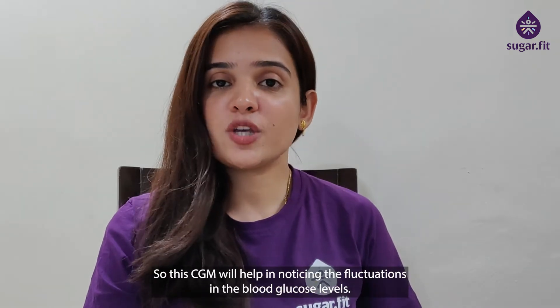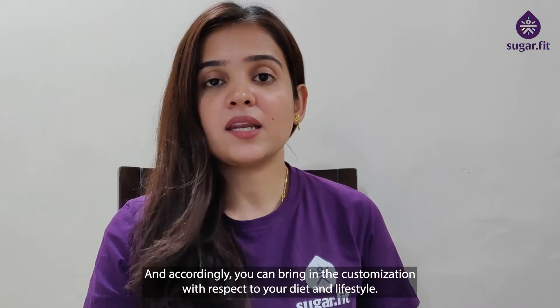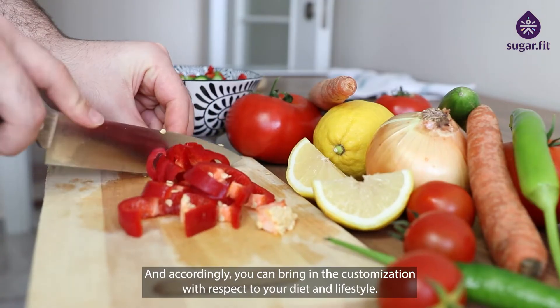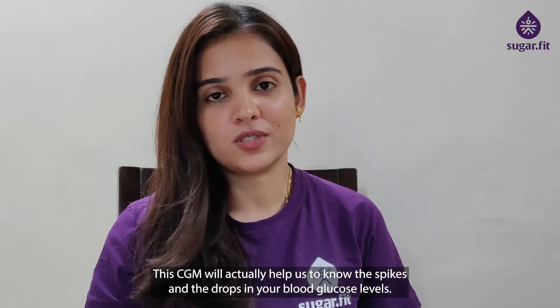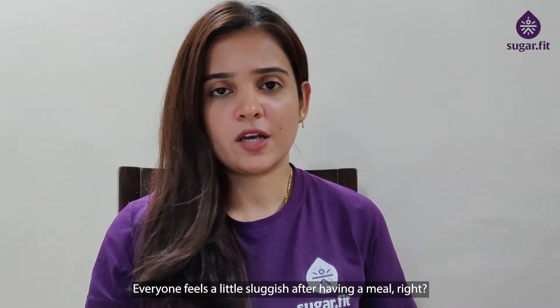This CGM will help in noticing the fluctuations in blood glucose levels, and accordingly you can bring in customization with respect to diet and lifestyle. CGM will help us to know the spikes and drops in your blood glucose levels. Everyone feels a little sluggish after having a meal.